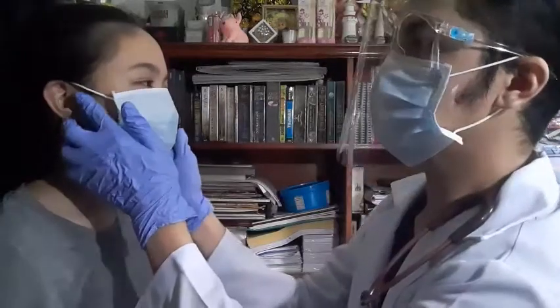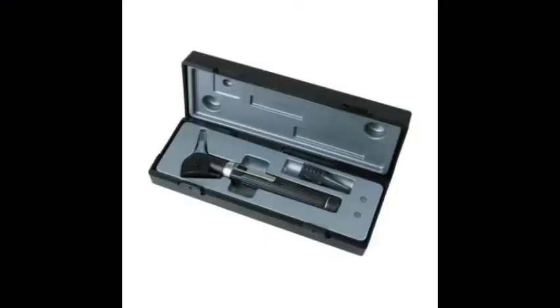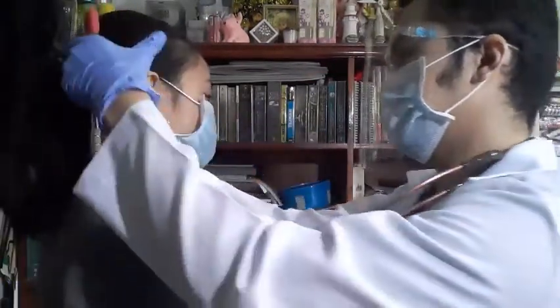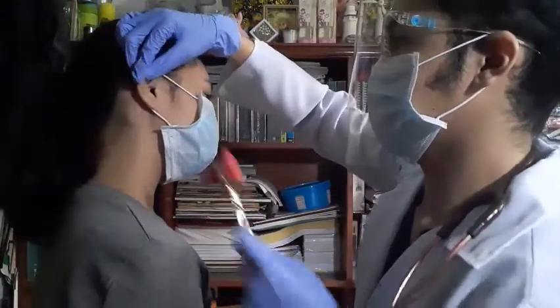Inspect the auditory canal using the otoscope. In this video, we used a reflex hammer but it's not a viable substitute in the actual practice. Ask the patient to tilt the head slightly away from the side being examined. Choose the largest speculum that the patient's ear will comfortably accommodate. With the other hand, straighten the ear canal by pulling the auricle gently upward and backward.